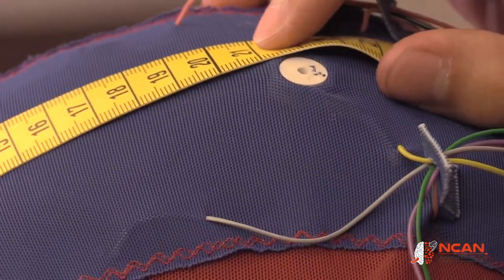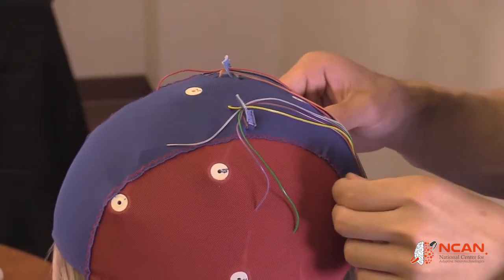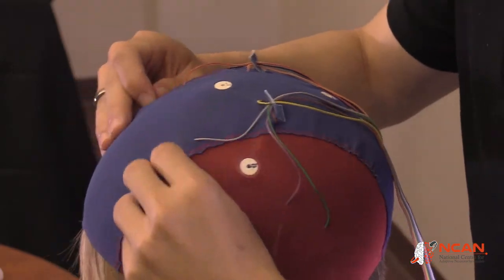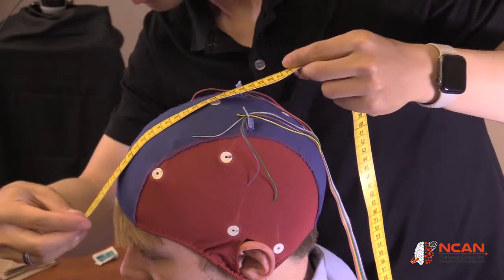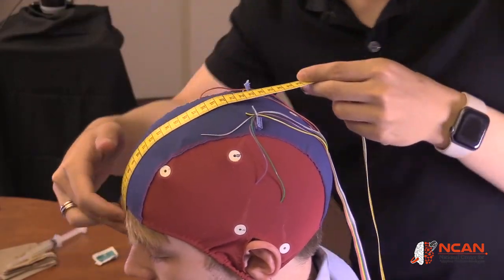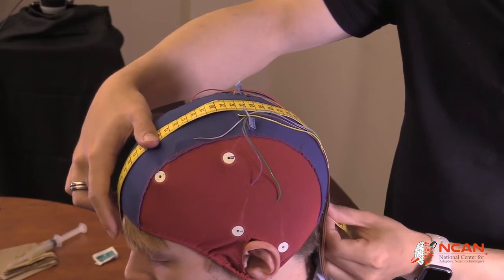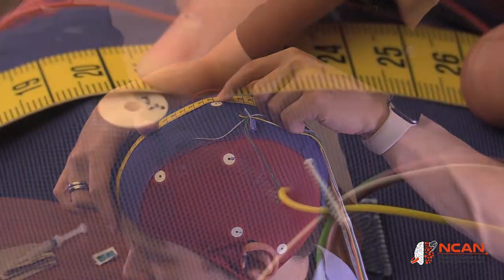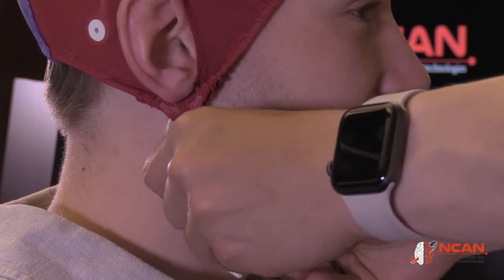Adjust the cap if CZ is not 20.5 centimeters from the nasion. Once the cap is aligned correctly, we can close the chin strap.